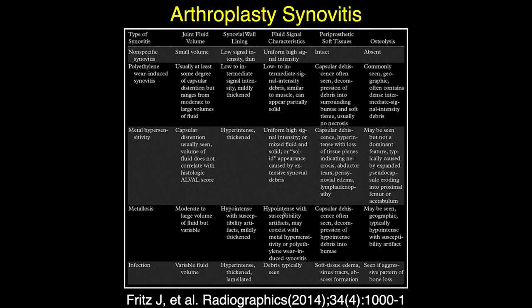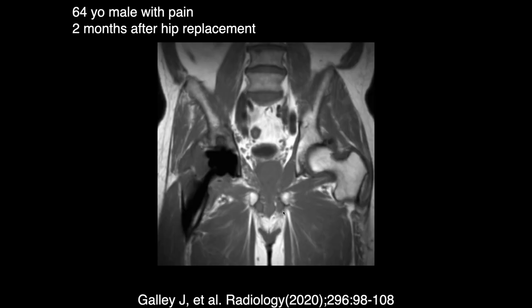And then there are a lot of reasons for synovitis that you look for. Typical synovial thickening. If you give contrast, you'll get enhancement of the synovial thickening, and then you'll get increased effusions and cystic masses around the joint space to look for.